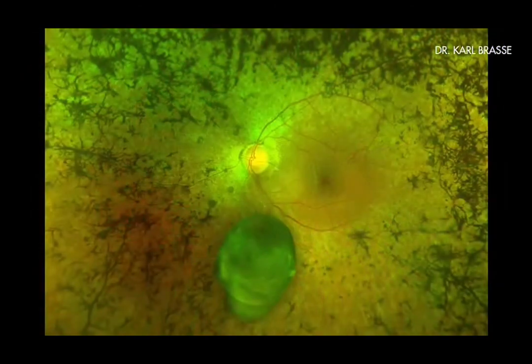This case shows the variability of vitreous floaters. We are looking at a giant floating cyst originating from the epithelium of the ciliary body, which histoanatomically is group 1. Puncturing the cyst with the YAG laser to make it hopefully shrink might be an option as an alternative avoiding vitrectomy. The peripheral visual field of this desperate 40-year-old lady with retinitis pigmentosa is already very much impaired. The floating cyst even blocks her central field intermittently.